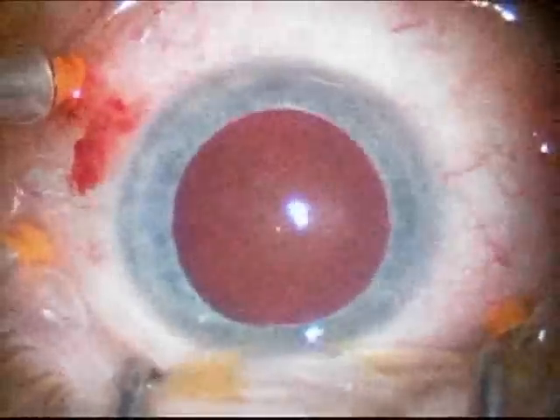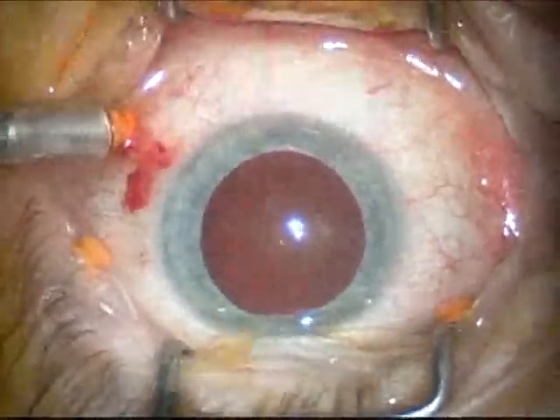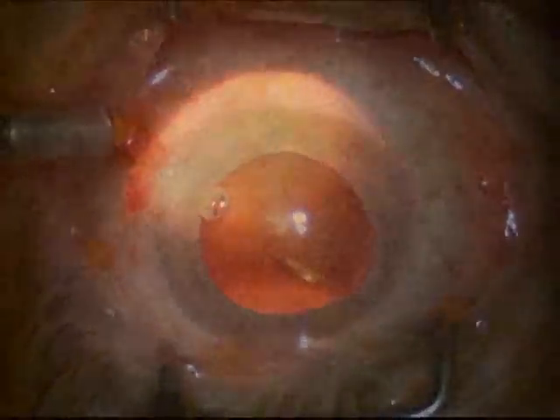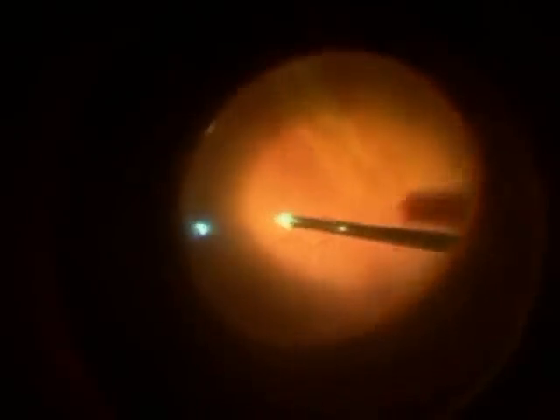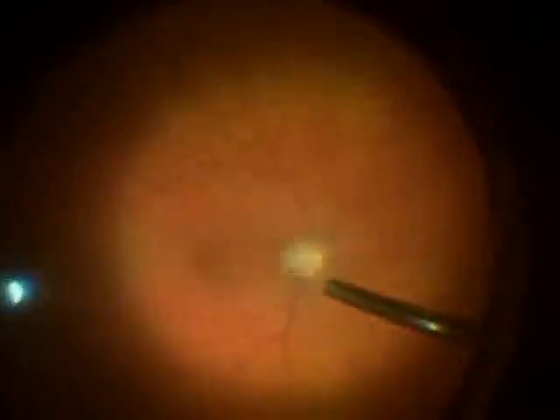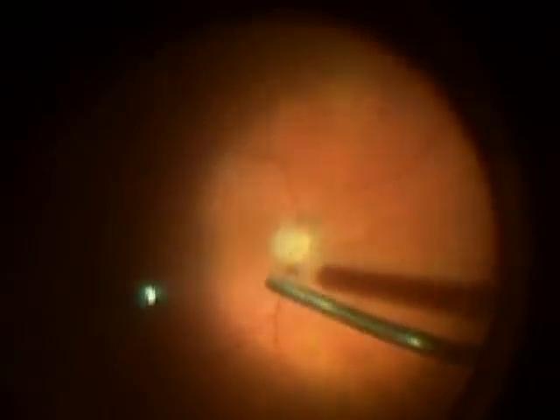It has to be removed though to allow adequate visualization of the intraocular contents. At this point you're viewing the inside of the eye through a special lens system. On the right side of the picture is the vitrectomy probe and on the left side is a light pipe. Initially the vitreous is removed from the front part of the eye. Here some of the vitreous has been removed and the vitrectomy probe on the right is being used to suck the vitreous off of the back surface of the eye.